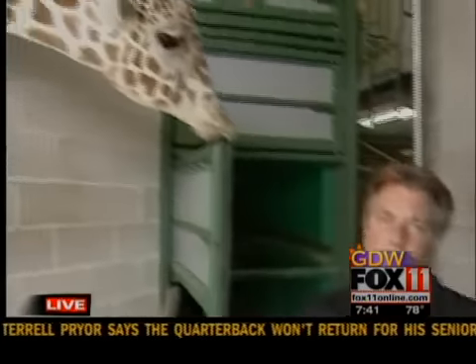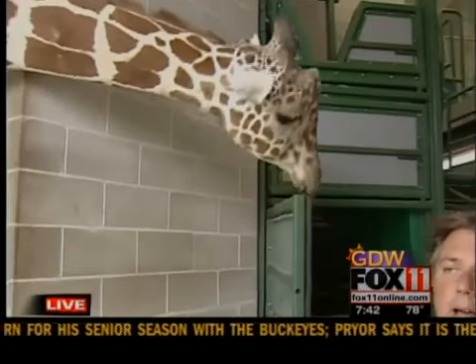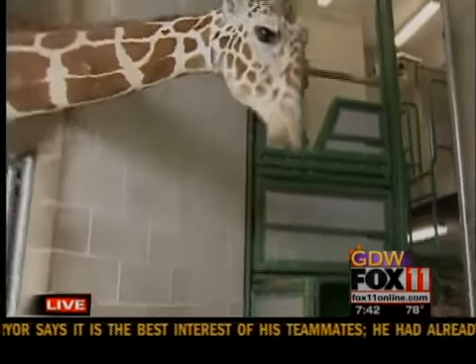So we saw a little spot there, but we still didn't know, was there an infection in there or not, like a laminitis deal or whatever. So what we had to do is, oh yeah, she loves playing around with anything. But what we had to do then is go ahead and do an X-ray.